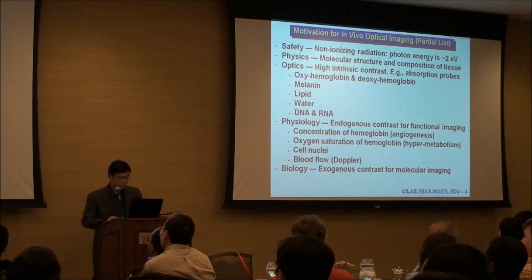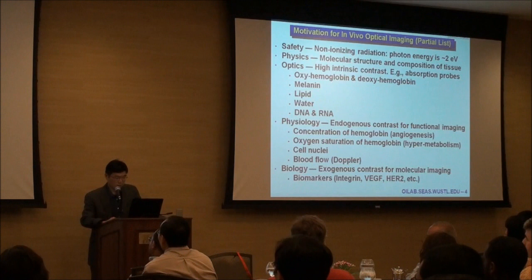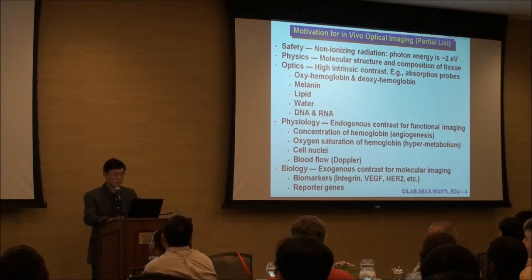Logically speaking, we can introduce exogenous contrast into the body to provide you molecular imaging. We can image biomarkers and even reporter genes. So this is a short account of the capability that light can provide you.